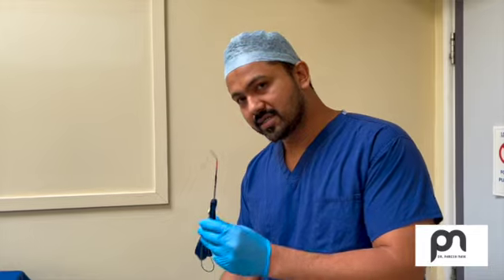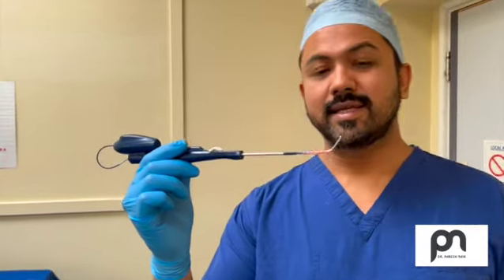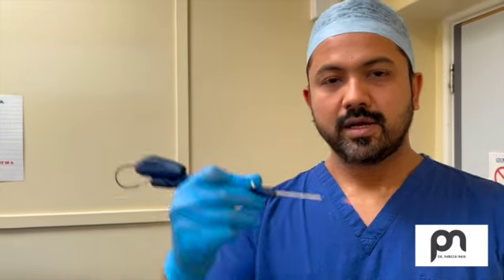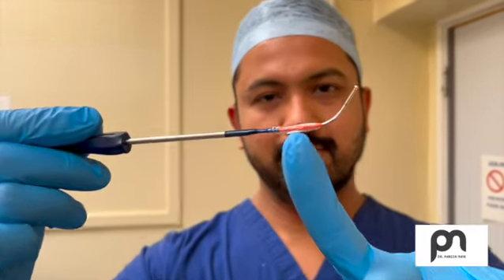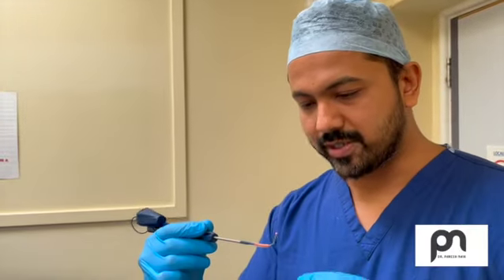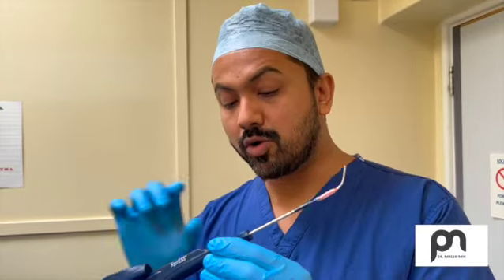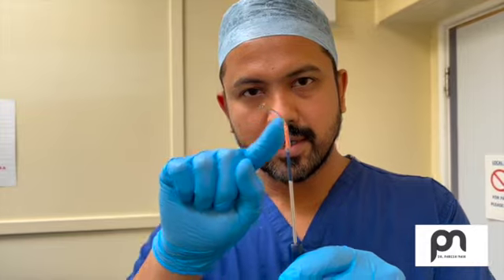So how does this system work? This is the balloon dilation system. You hold it over here like a pen, and this is the probe. This is the balloon, that's the probe. The probe will guide into the ostium. We have a mold that comes along with the system where you can change the angulation of the probe.